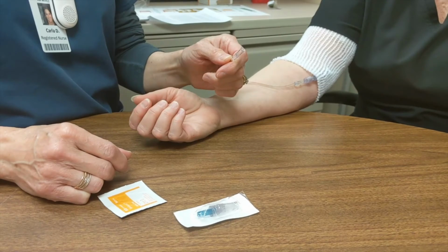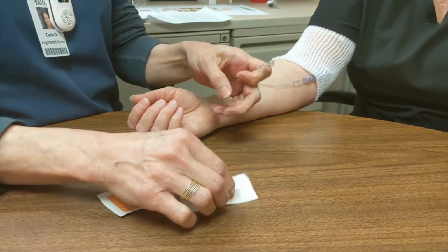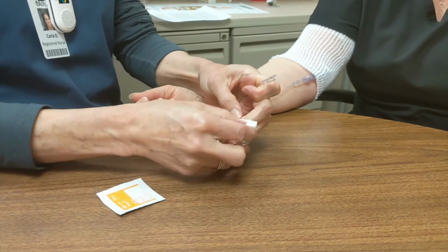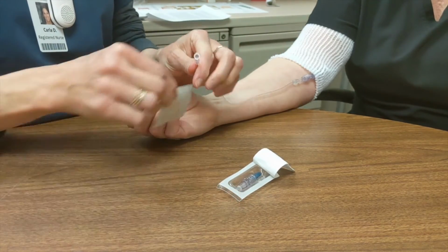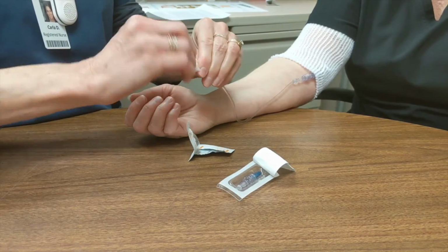If you accidentally remove the clave, do not put the original one back on. Open the new clave from the sterile packaging. Leave it sit in the packaging. Clean the end of the line with a new alcohol wipe. Hold on to it, not letting it touch anything.